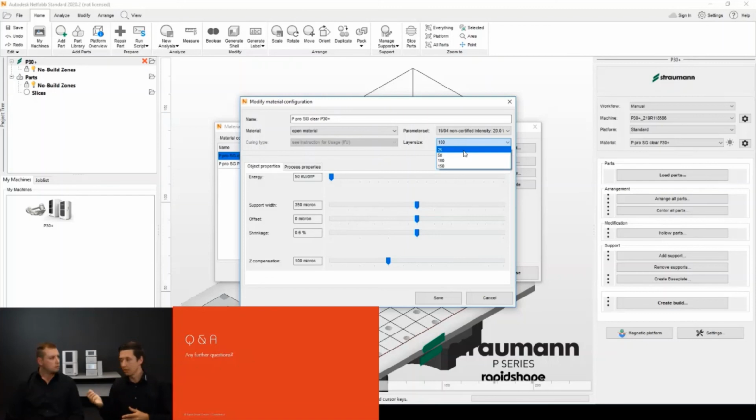Which is, like Iggy already mentioned, the resolution we've got is totally fine to use with all indications at the moment which are available on the market. Yes, but please note though, if you are looking at printing thinner layers, this can be achieved. You will just need a unique developer setup for your version of Netfabb, which will allow that. But this is something that can be covered in a future webinar. We are trying not to get into too much detail on each topic so as not to sidetrack the whole objective of this.